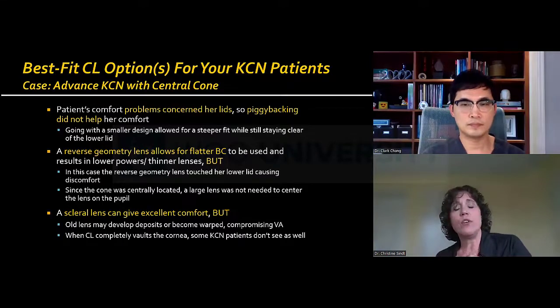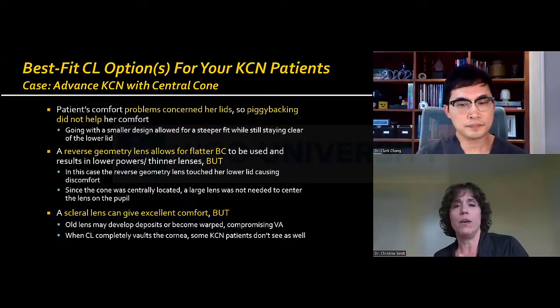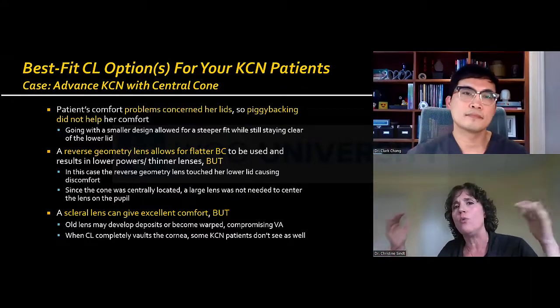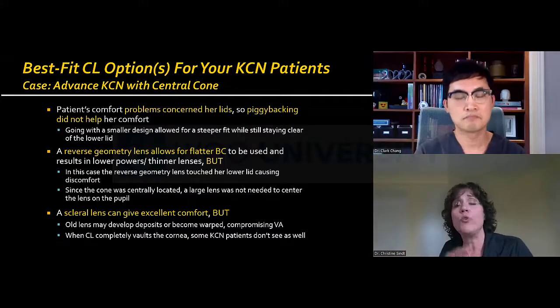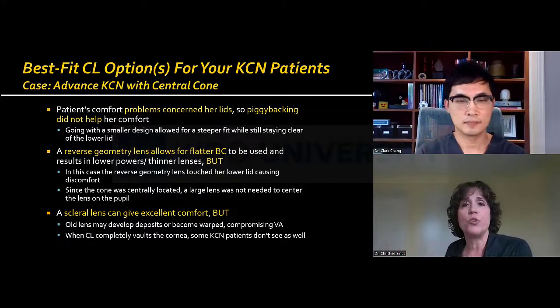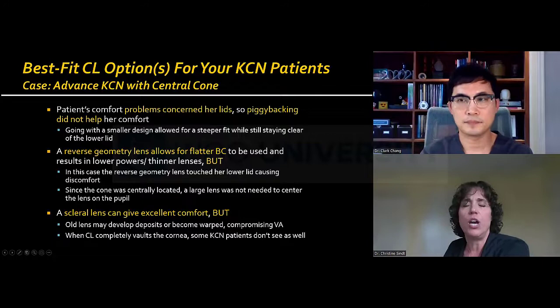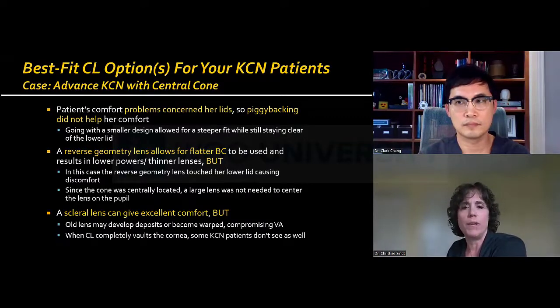A scleral lens is often a very good option for these steep central cones as well, but when you get too steep, when you get too advanced, and then you vault the cone altogether and you don't have that gracing touch, sometimes you tank their vision. And if their goal is to stay out of surgery for as long as possible, sometimes your best option is actually to touch the cone and keep them out of surgery longer, knowing that eventually they may need surgery as well, and educating that patient accordingly.